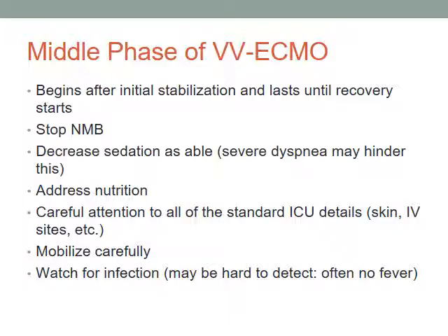And then we want to mobilize these people carefully. Sometimes they tolerate moving very well, sometimes even slight movement leads to cannula flow issues. It's a case-by-case thing, but we do want to mobilize them, including bed and chair, dangling out of bed, and potentially walking in the selected proper patients.